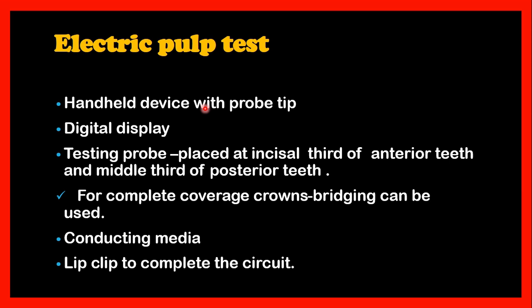The positive result comes from the ionic shift in the dentinal fluids within the tubules that causes local depolarization, and this local depolarization will subsequently generate the action potential from the intact A delta nerve fibers. To simplify, basically the electric pulp test denotes that some viable nerve fibers are present in the pulp and they are capable of responding.